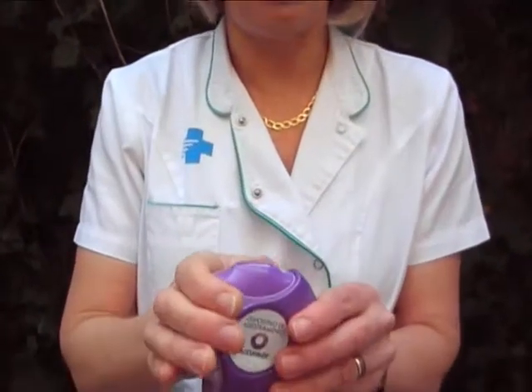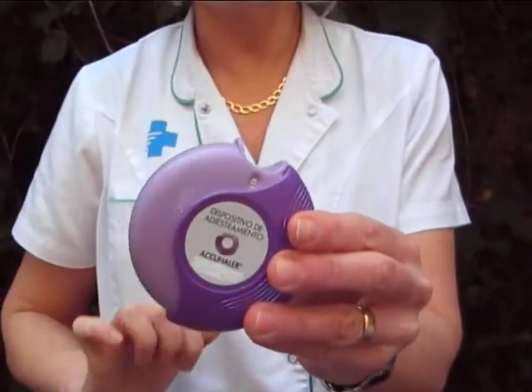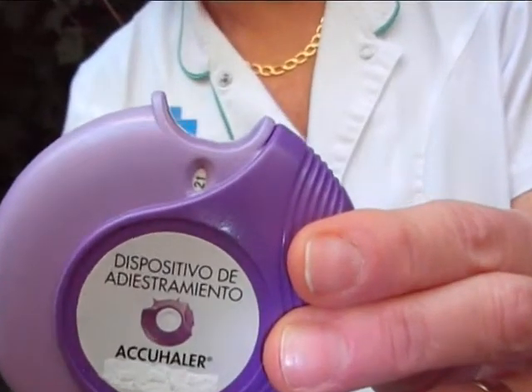Close the inhaler by pressing the thumb grip back to its initial position and rinse out your mouth with water. You can see that there is a counter that indicates the remaining doses.